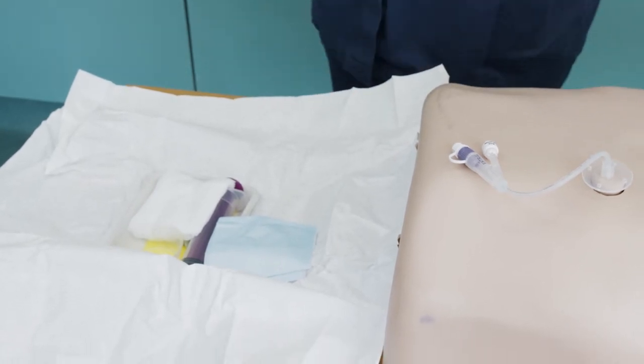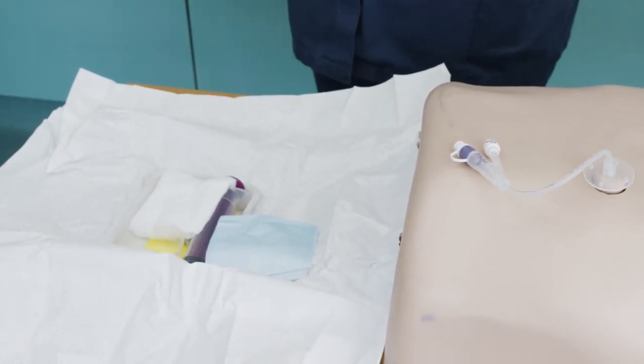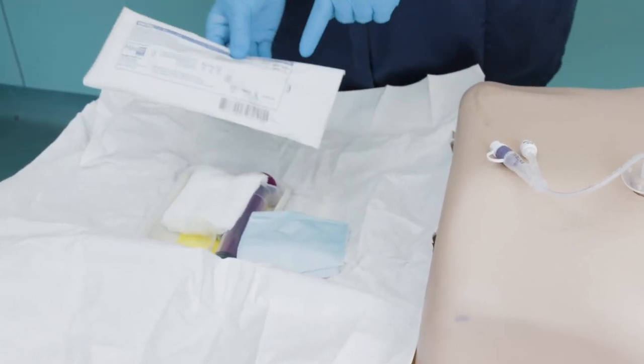Now select the rest of the equipment to be used, check the condition, size of the new tube, and use by date of the other equipment.